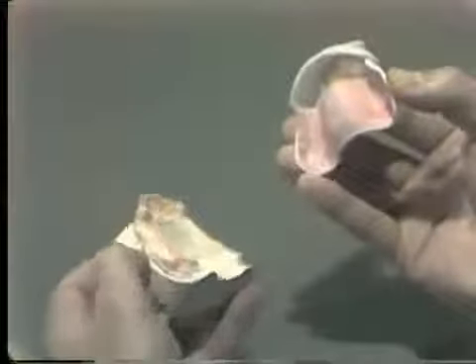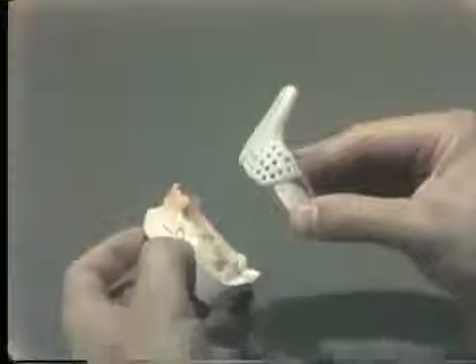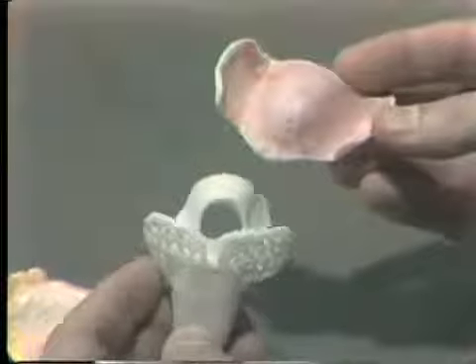If they do not come out in one piece, they are very easily keyed back together out in your hand. So this is how we do the sectional two-piece tray for the securing of a final impression for a maxillary immediate denture.